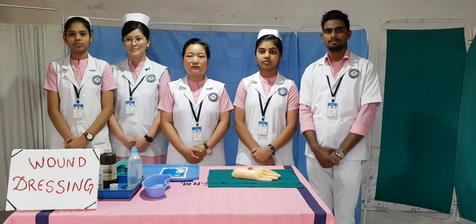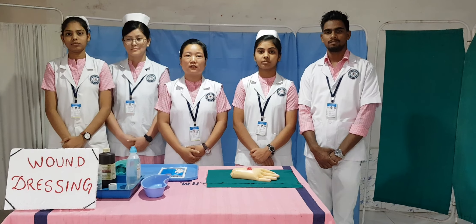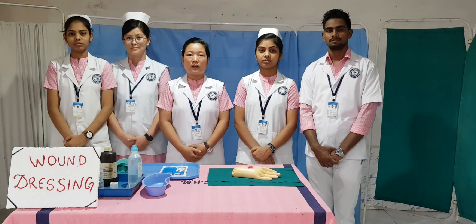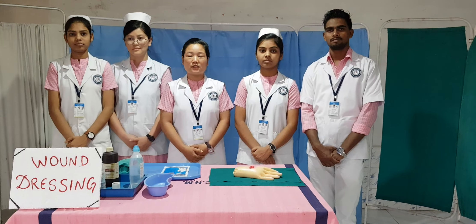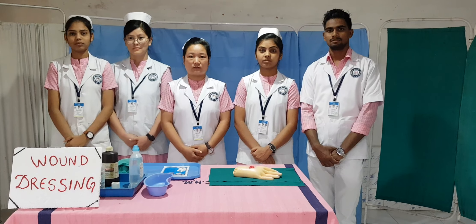Good morning everyone. We are the students of JNM Second Year School of Nursing, Christian Hospital, Munggili. Now we are going to demonstrate the procedure which is based on infection wound dressing simulation.